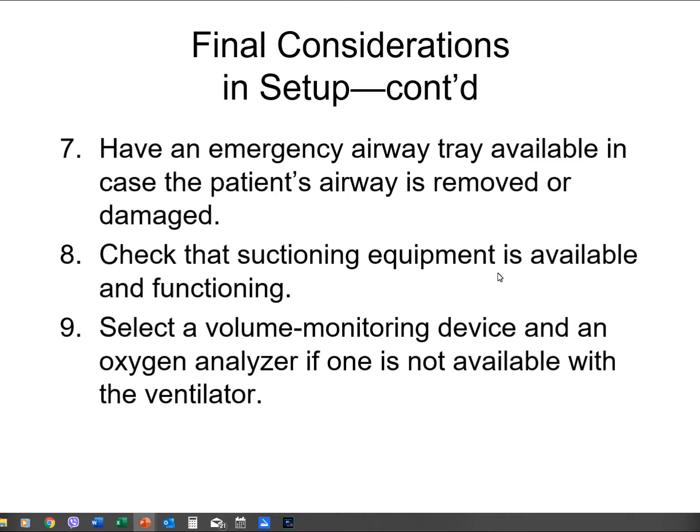You can determine if your oxygen analyzer is not working because it might say something like low O2 sensor, or I think on the Esprits, it'll just say low oxygen, regardless if you plugged it into the wall unit and you have oxygen running through and it's saying low oxygen. That's probably the analyzer needs to be changed, and that's when you would have to pull the ventilator out of service, tag it, and let your lead or your supervisor, manager, director know that there's something wrong with it and it might just need periodic maintenance.